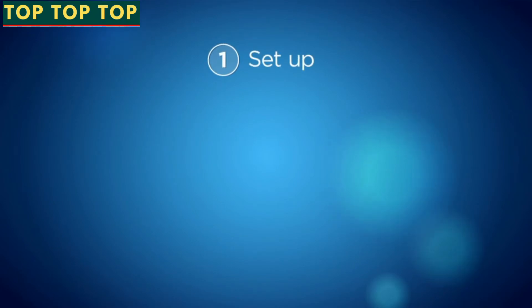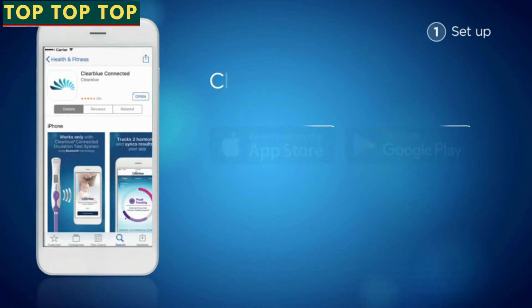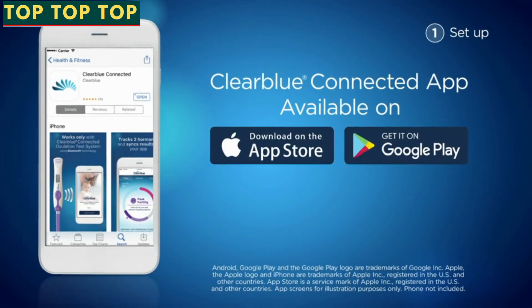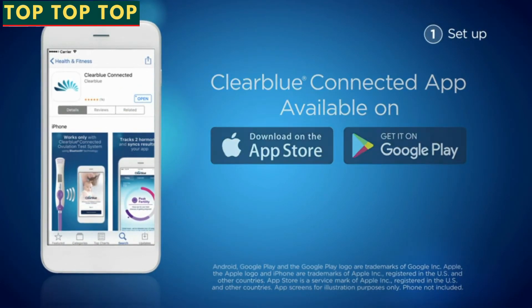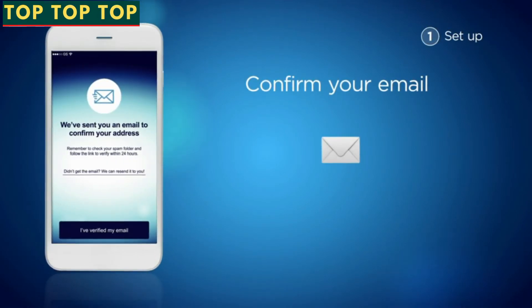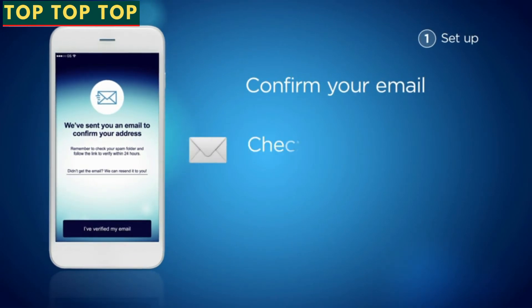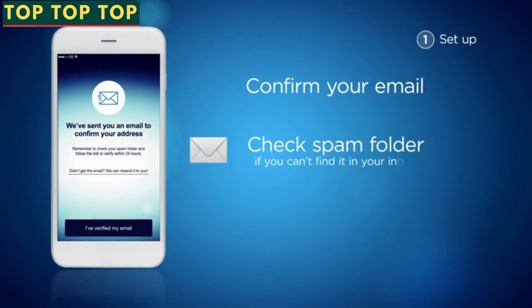Step 1: Setup. To start, you need the Clearblue Connected app. Search for it on the App Store or Google Play and download it onto your phone. Create your account and confirm your email address by clicking on the confirmation link that has been sent to your inbox.